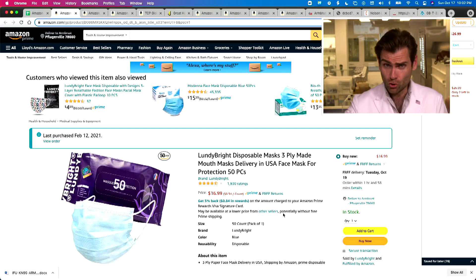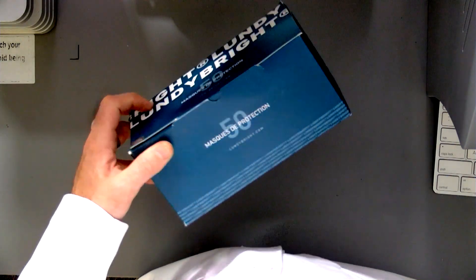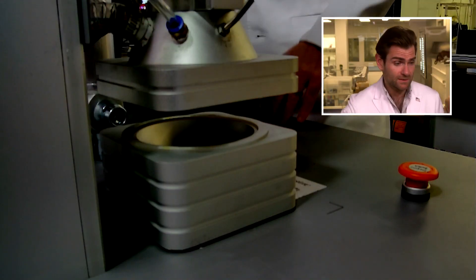Hey everyone, welcome back to the place where we're testing every single mask on Amazon. Today, very excited to look at the Lundebright mask. It's an interesting brand. I like the packaging quite a bit — soft touch box. Let's put it in the clamper and see what happens.